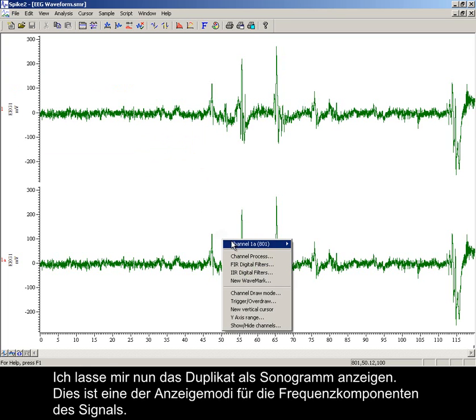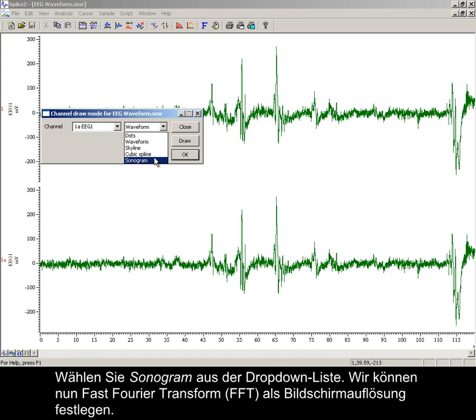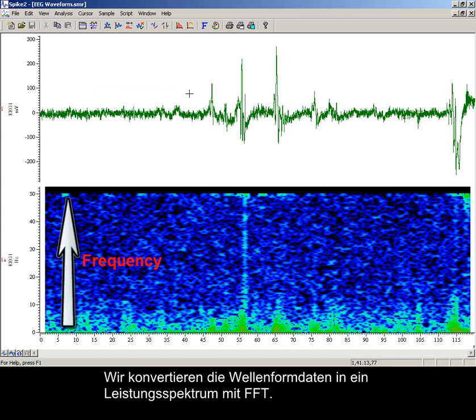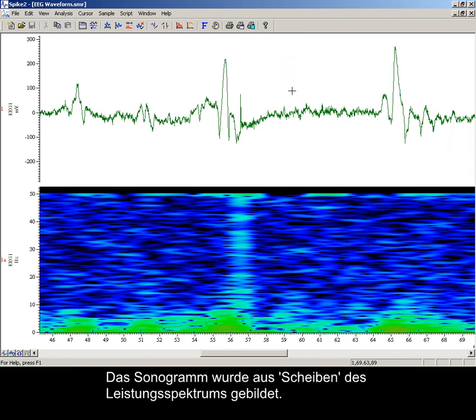Now to display the duplicate as a sonogram — this is one way of displaying the frequency components of the signal. We use channel draw mode for this, then select sonogram from the drop down list. We can now specify the fast Fourier transform resolution of the display. We use the FFT to convert the waveform data into a power spectrum. Sonogram mode shows how the frequency content of the waveform channel changes with time.